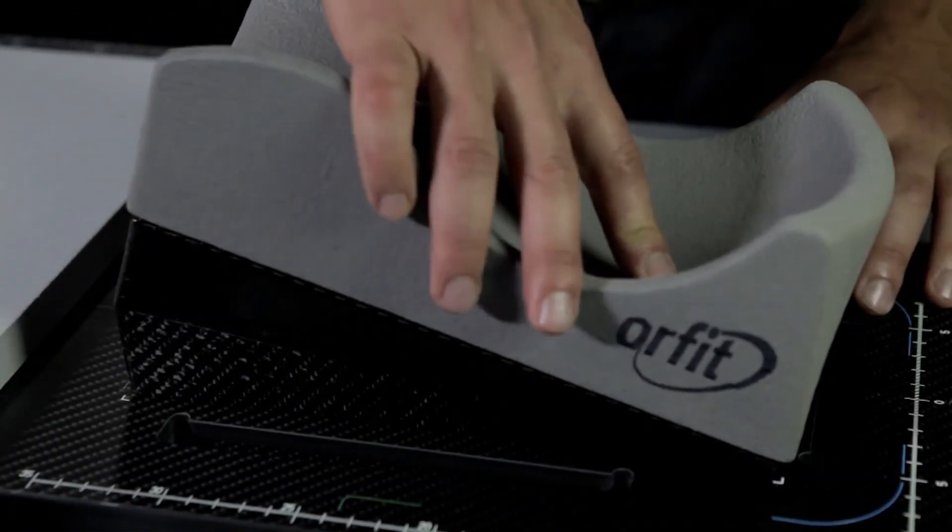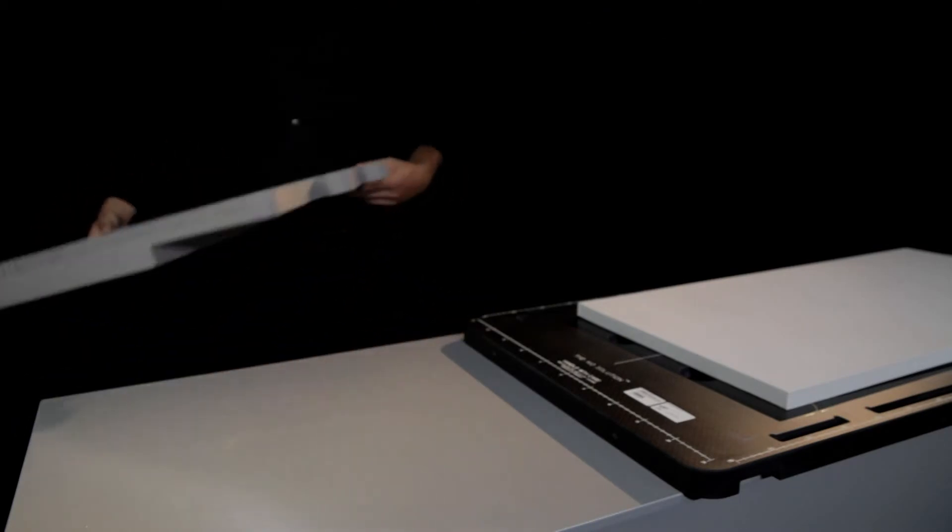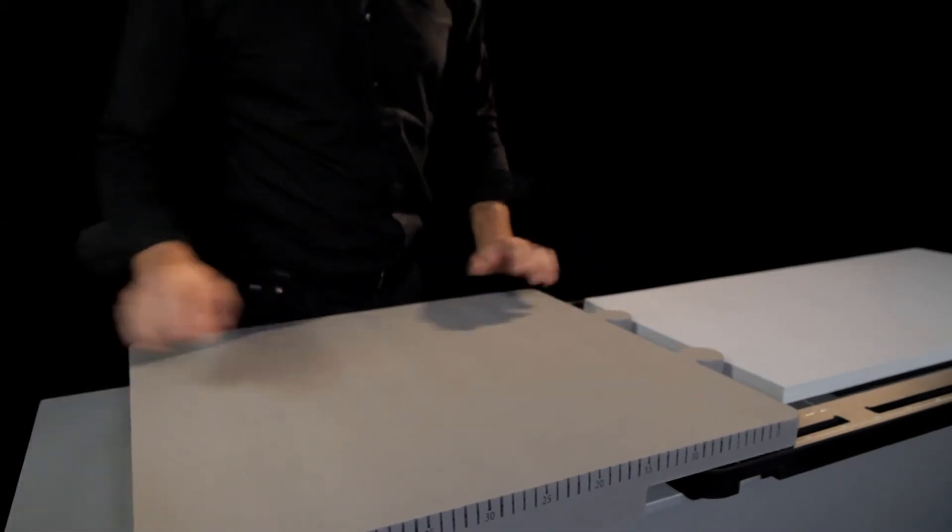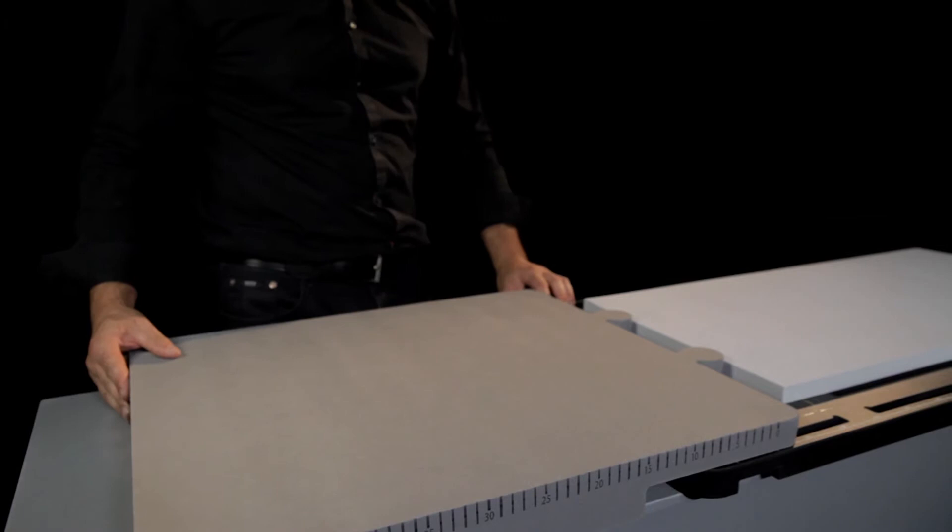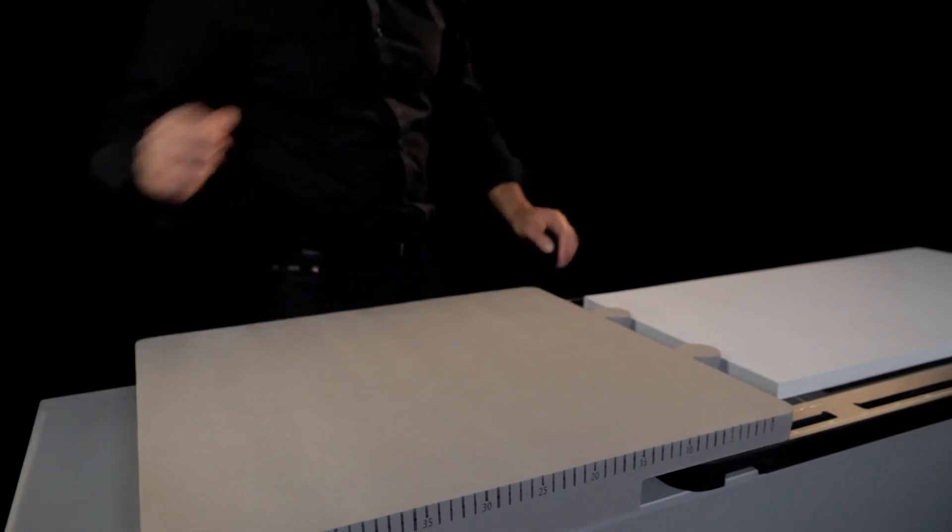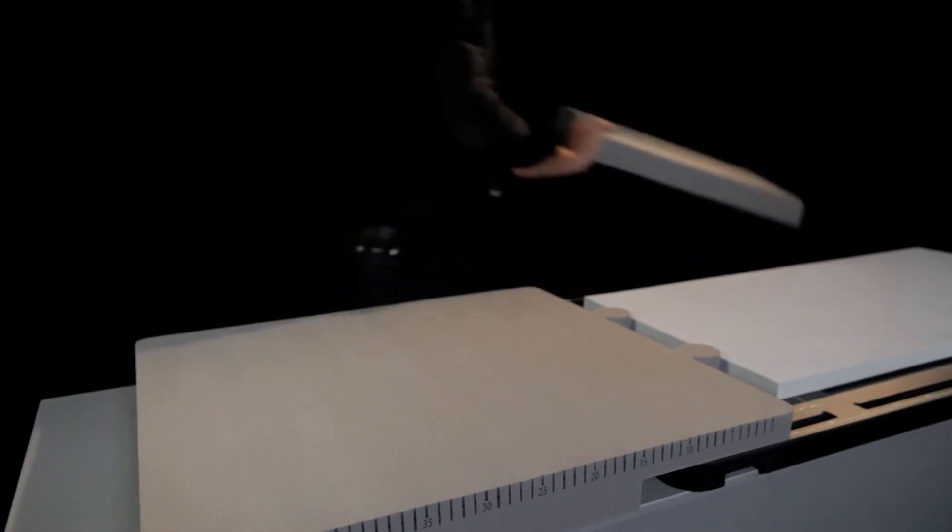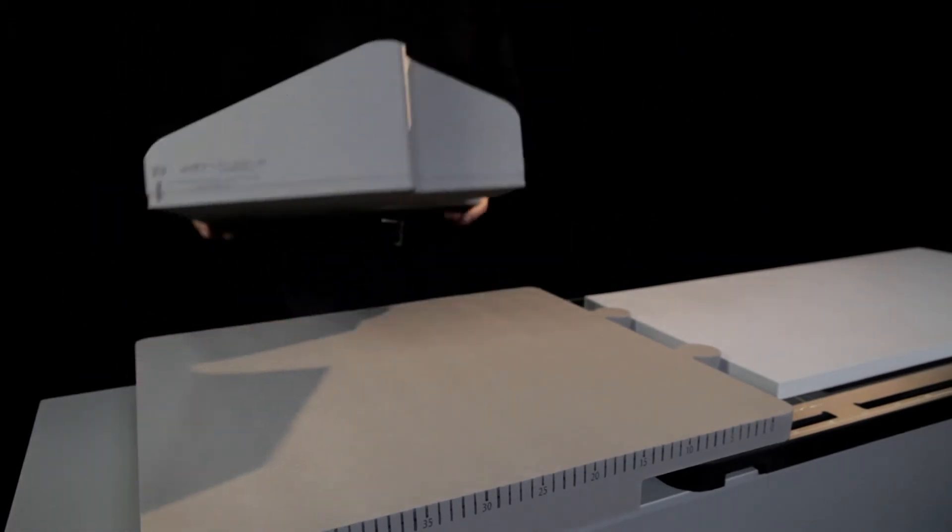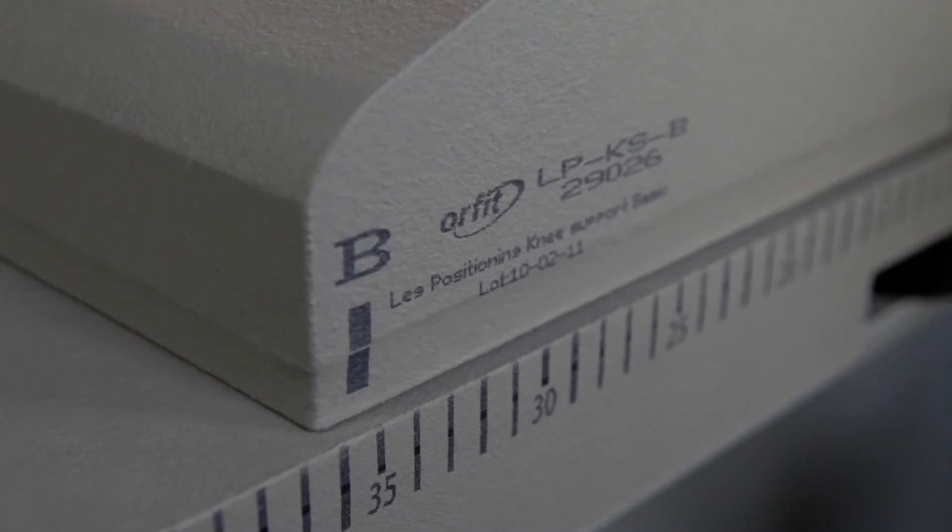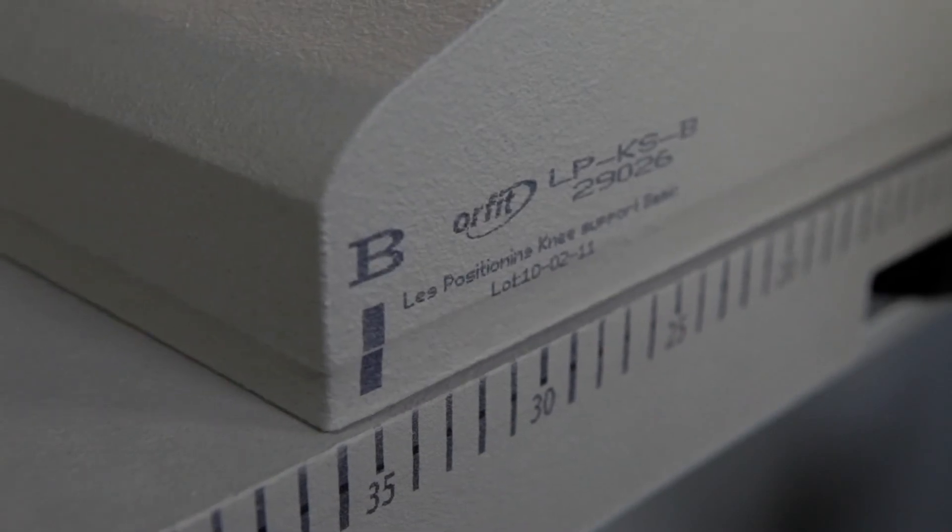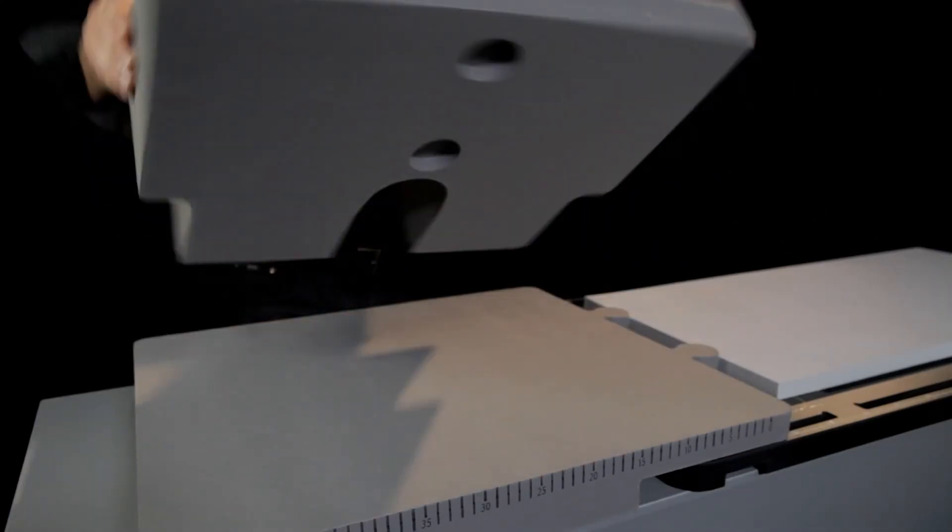The patient's legs are supported using the knee and leg positioning set. This set of grey cushions consists of a flat base cushion with a scale printed along one side. Other elements of the set can be placed on top of this cushion.